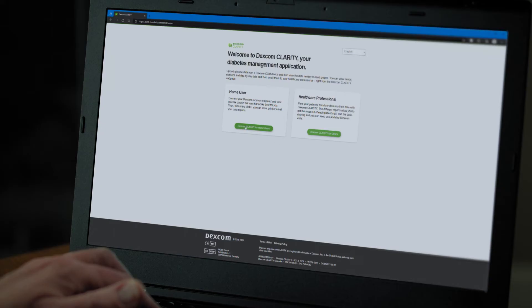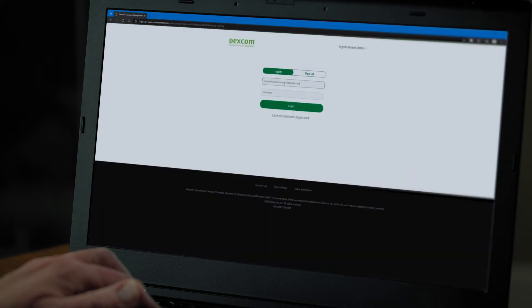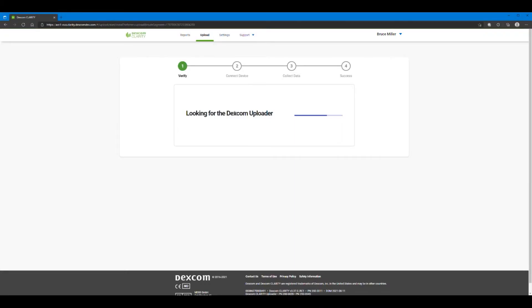After you create your account, you'll return to the Clarity page. Click Dexcom Clarity for Home Users. Log in with your Dexcom username and password. Now click Upload at the top of the screen.